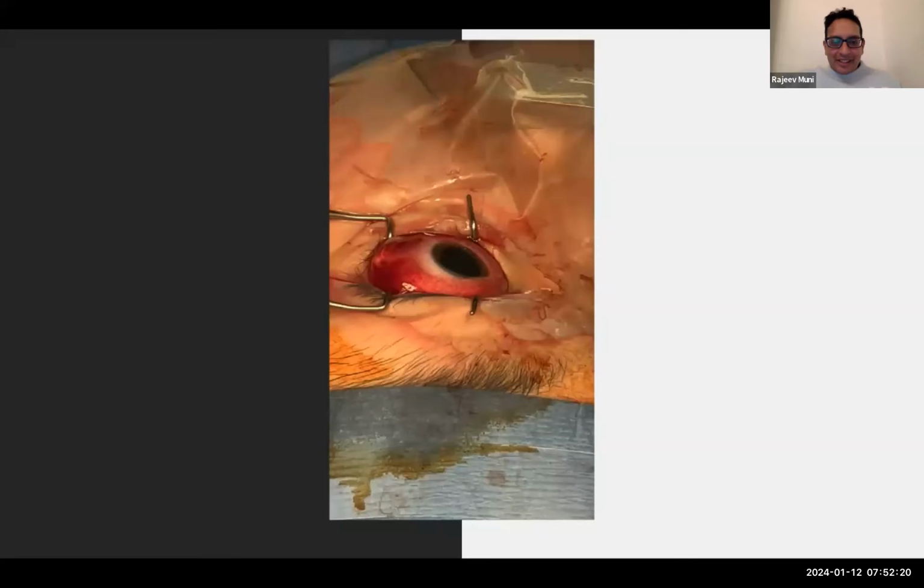Because you're trying to preserve all that conjunctiva, you're making your life a little harder by not opening everything up. I'm sure if others are interested, we'll find even more elegant and efficient ways to do this with minimal tissue trauma, and you'll find ways to make this easier as you do more.